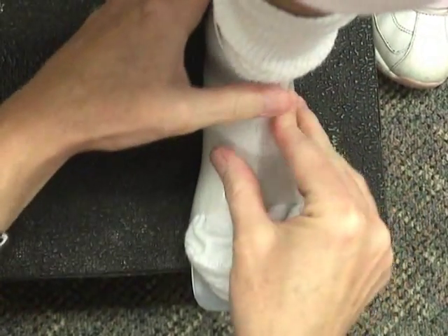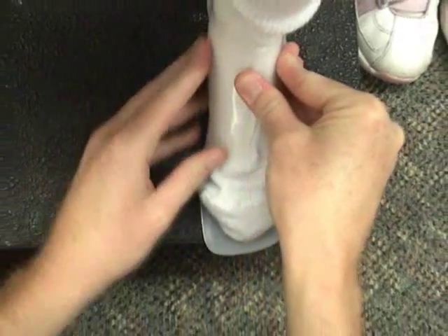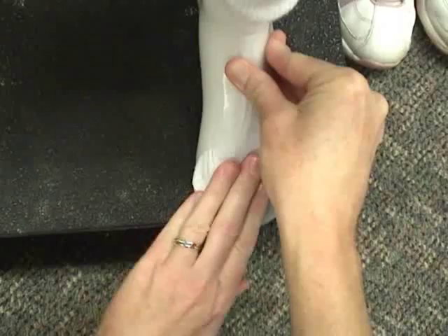If the edges of the instep area overlap when you've put it on the patient with a sock, the jumpstart is definitely too big, or at least has too much volume.